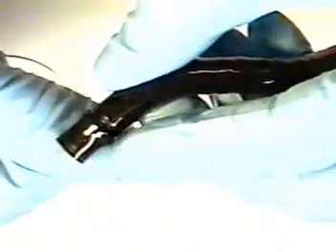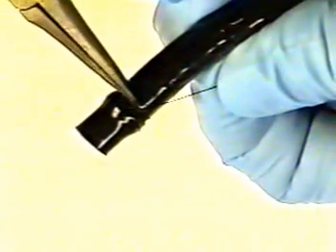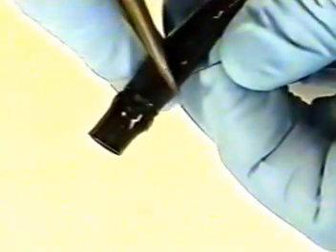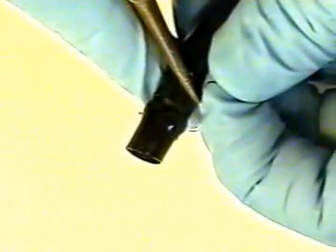Once we have reached that point, we can take the end of the black silk thread, pushing it through the loop, holding it tight. We will pull the end of the thread which feeds underneath all the new bindings, pulling the loop to the edge of all the bindings. Once that loop or knot is flush up against all the bindings, we will take our needle nose pliers and pull that loop underneath all the bindings approximately halfway.